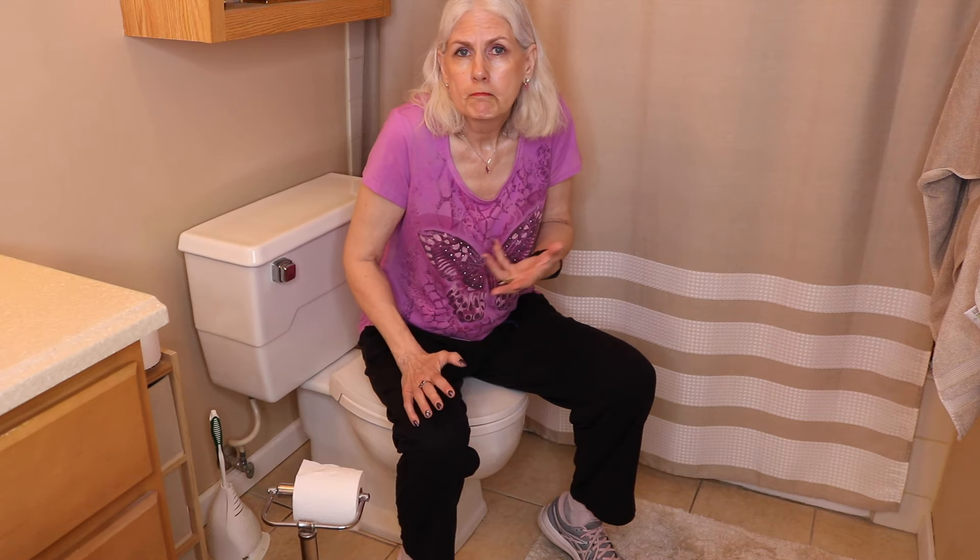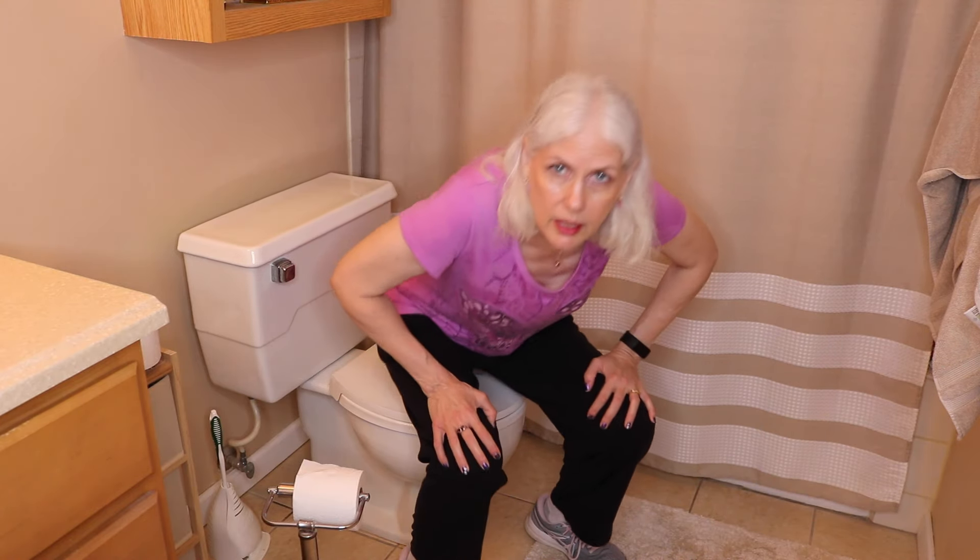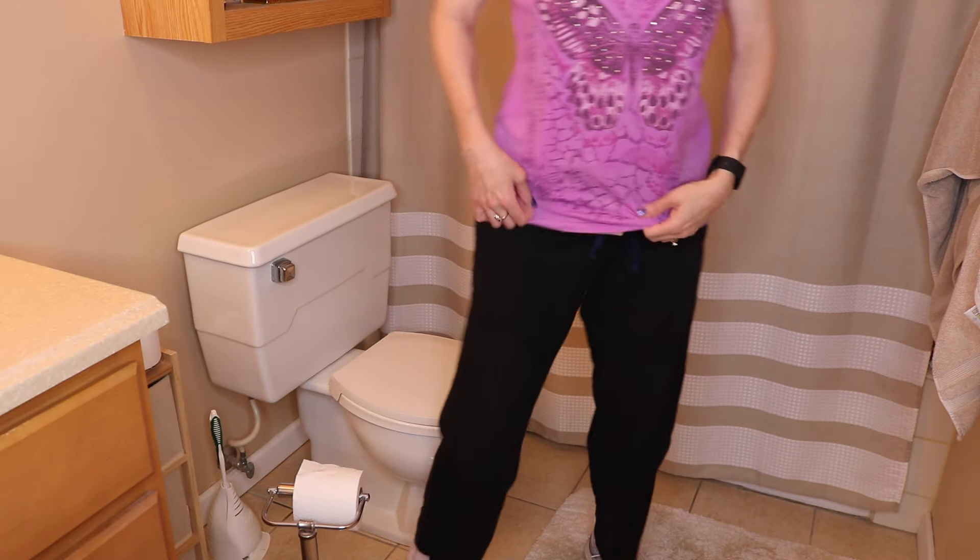I just took a shower and changed my bag. My bag is clear — you will see my stoma through there, and it may start pooping. I have no control over when it does that or not, so we'll see how this goes.